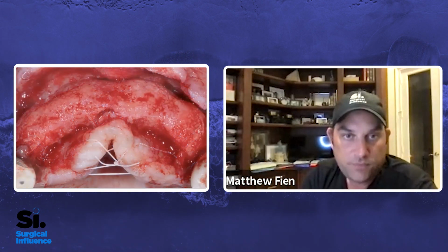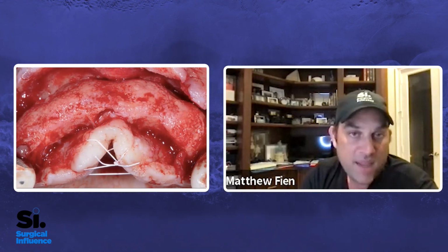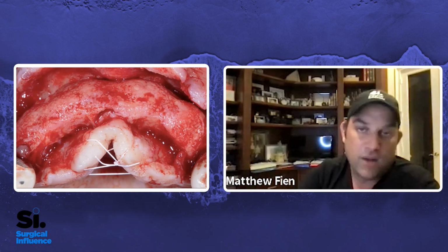And this is an approach that has saved me numerous times because this turns a really challenging defect into 2 easy sausages, right? So just like Israel, I tacked both membranes, actually using fixation screws probably, and the implant handpiece adapter on the palatal, pack the bone, fold it over that buccal-occlusal line angle, and then can get it really nice and taut. And you can see, we can certainly regenerate these types of defects. But I think by using the tacks and the screws, I can pack more bone and I can get it a little bit more taut.